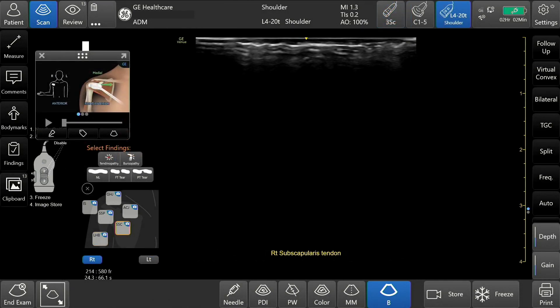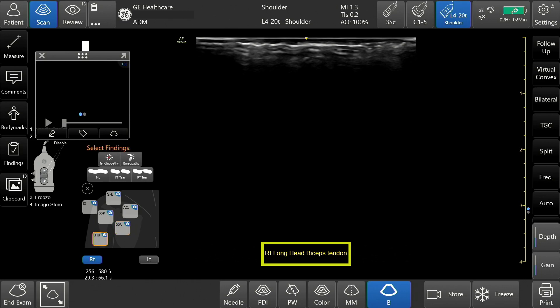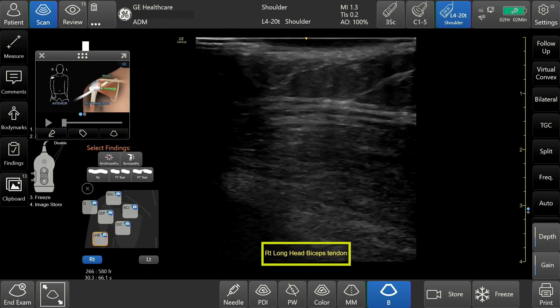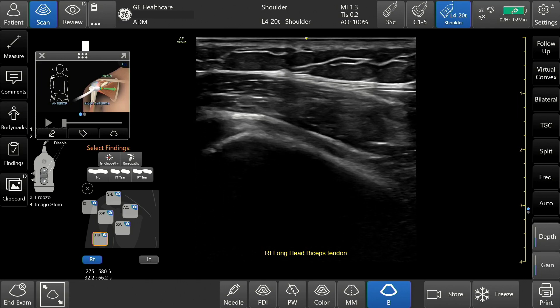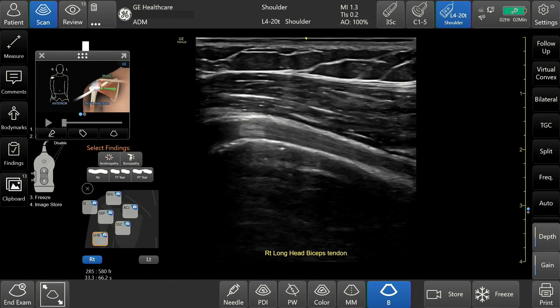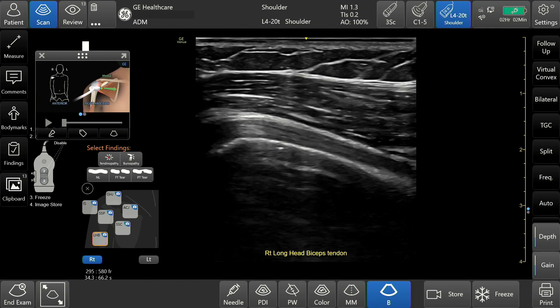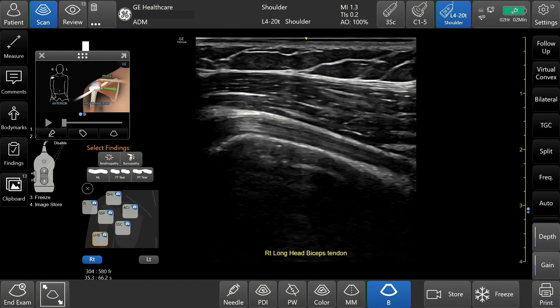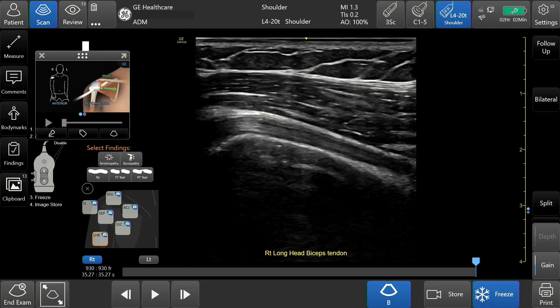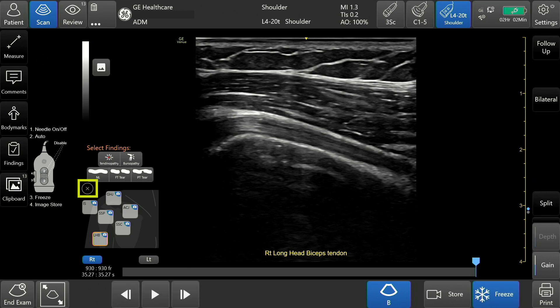Tap the desired zone on the shoulder diagram — in this case, LHB. The correlating comment will appear at the bottom of the image. The user can minimize the reference image or the diagram at any time by tapping the X at the upper left-hand corner.